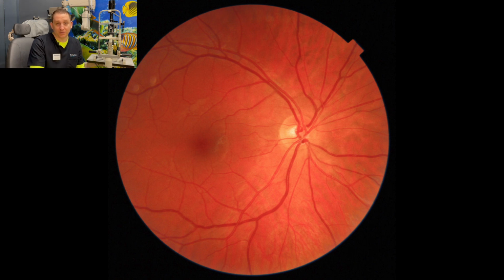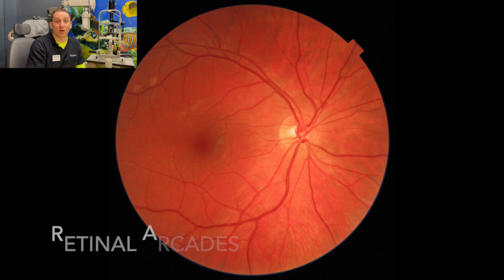So the orange donut's probably going to be the first thing that sticks out to you. That's called the optic nerve. That is a direct connection to your brain to help you process and see the world in front of you. Coming out of the optic nerve are blood vessels, veins, and arteries that span the entire reaches of the retina, and the ones that you see are called the retinal vasculature, specifically retinal arcades.